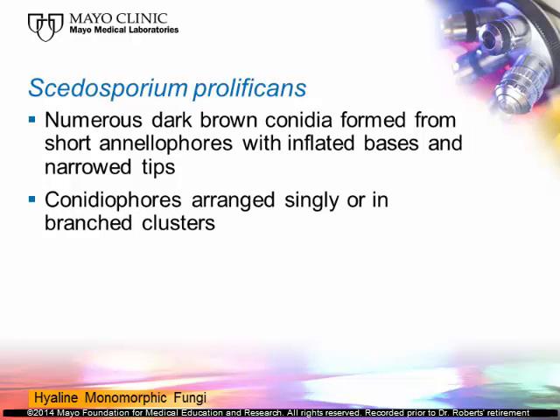This is another one that is seen in the clinical laboratory, and it's an important organism because it actually is a totally drug-resistant strain for the most part. And when it infects someone, it's very difficult to treat. This is one called Scedosporium prolificans. This organism had another name before it was called Scedosporium prolificans. It was called Scedosporium inflatum. And it was called that because the base of the conidiophore was inflated or swollen. And it's very obvious, and you'll see this here as we go along.